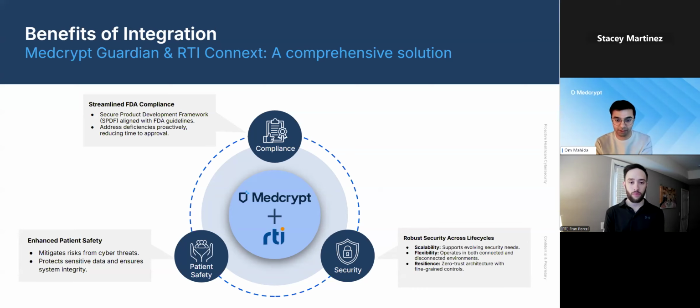We talk a lot about shifting left in cybersecurity, and it's really important in medtech, because usually at the time of submission, it's cram time. You're trying to get your documents and processes in order. You've done all the hard work of getting your clinical device to function and work, and the last thing you want is a truckload of new issues and requirements to solve for. So it's really important to shift left. Think of cybersecurity from day one of the design and development of that medical device.